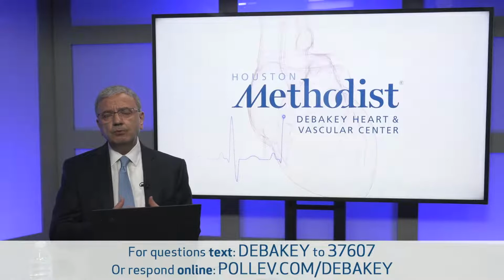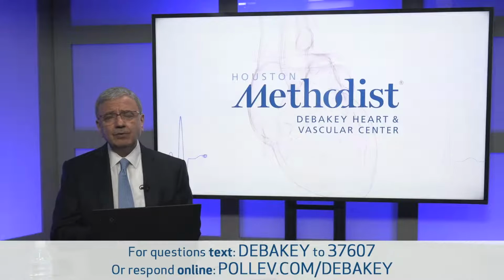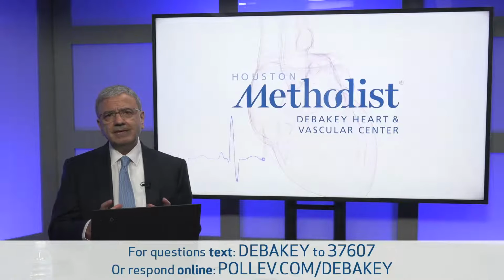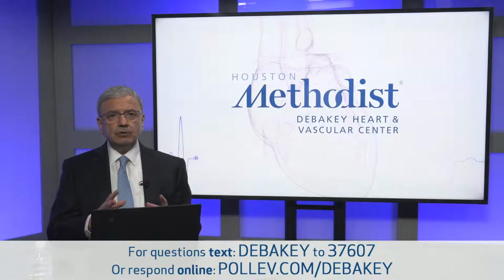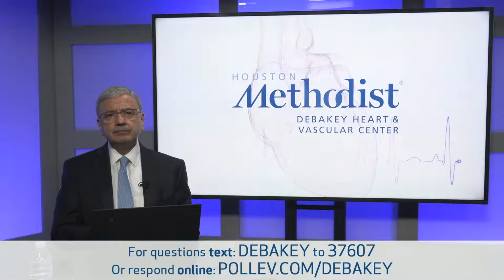It will bloom and super enhance. You should not use it for color Doppler of jets. Second, it will mask any abnormalities that you may see on valves. So valve calcifications, a thrombus on a valve, or more likely a vegetation on the valve, could be masked. So do whatever you need to do first. Decide if you want to use contrast to enhance either wall motion, regional, global function, whatever it is. I think these are your advantages here.